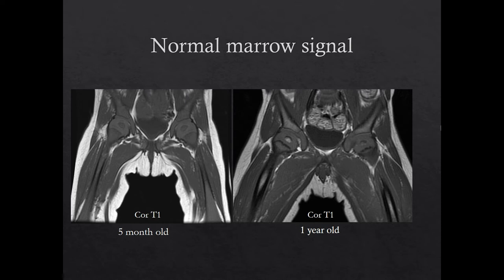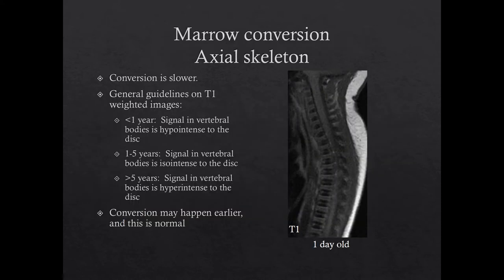Here are some more normal examples. On the left, the femoral head epiphyseal ossification centers have recently formed in this five-month-old. On this T1-weighted image, the femoral head epiphyses are of low signal and are still hematopoietic marrow because they are within six months of being formed. In this slightly older one-year-old patient on the right, the femoral head epiphyses have already converted to fatty marrow. In the axial skeleton, conversion to fatty marrow is slower, and red marrow may persist in the thoracic cage, the vertebral column, and pelvis throughout childhood and into adolescence.